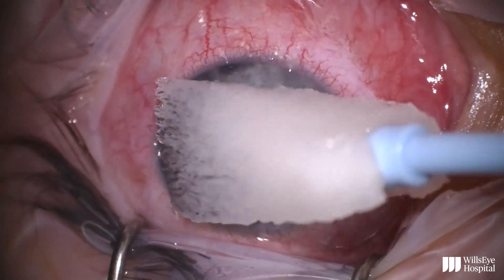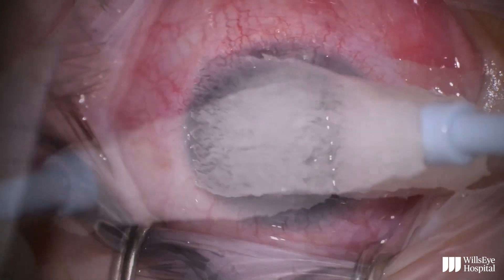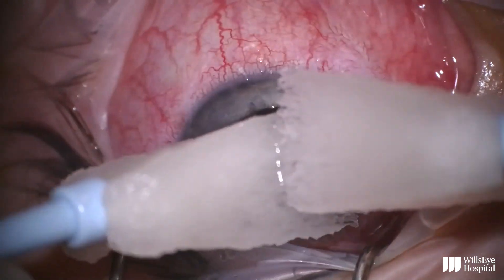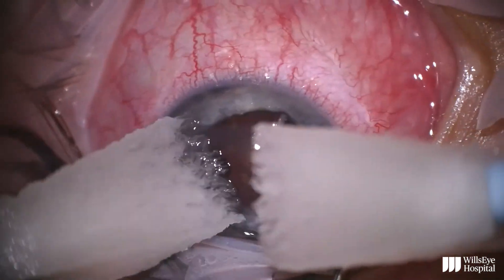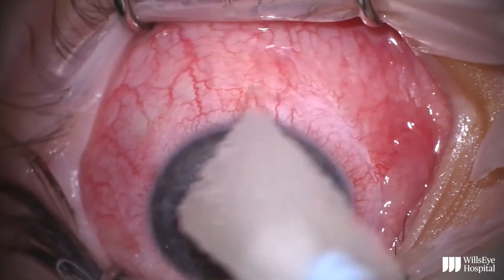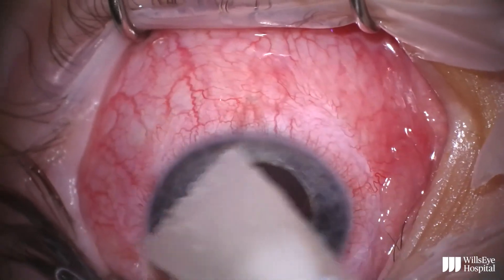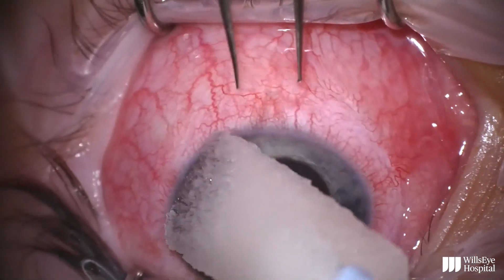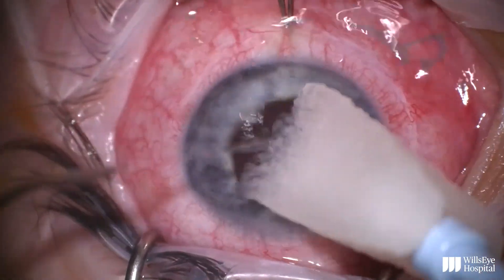Depending on the density of the calcium, this step can take some time, sometimes up to 15 or 20 minutes. But in general, the calcium does gradually clear over time, and at the end of the case we're left with a fairly clear cornea, and you can see a nice red reflex in this video.